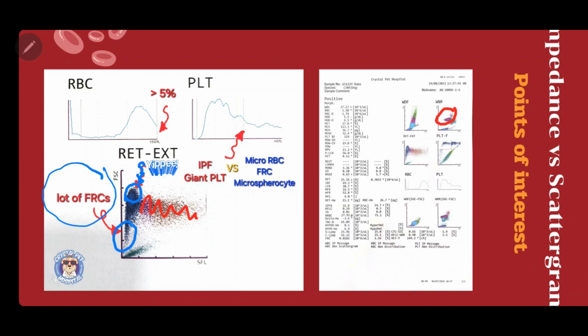There is a significant production of reticulocytes, but they still cannot become mature red blood cells because the FRC is high. No matter how much you regenerate and produce, if you cannot reduce the FRC, the production of RBCs will be relatively low or below normal. When this happens, NRBCs will appear.